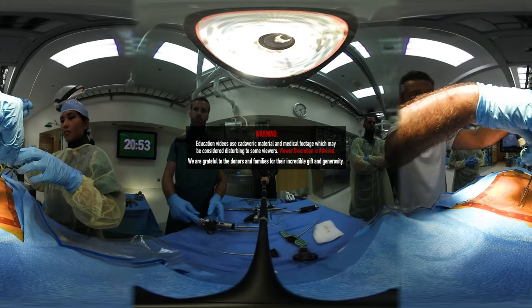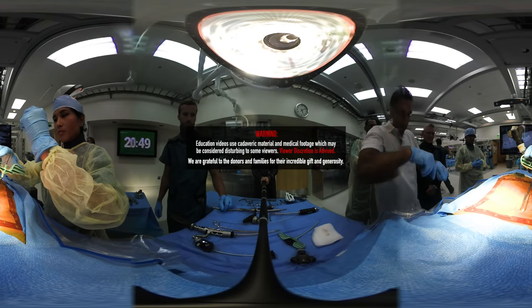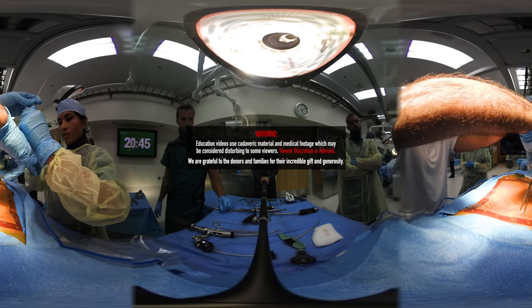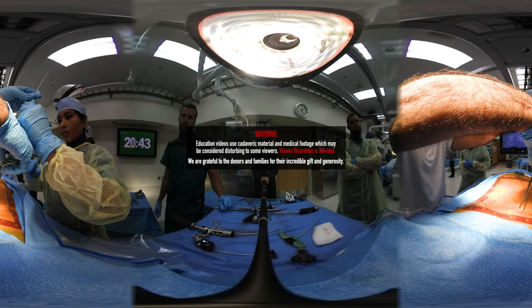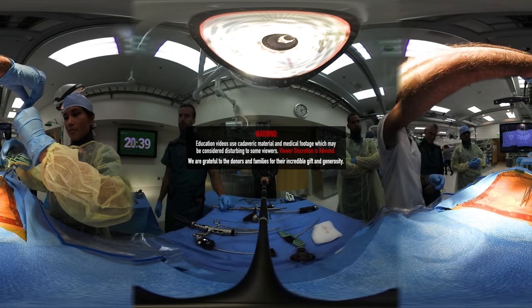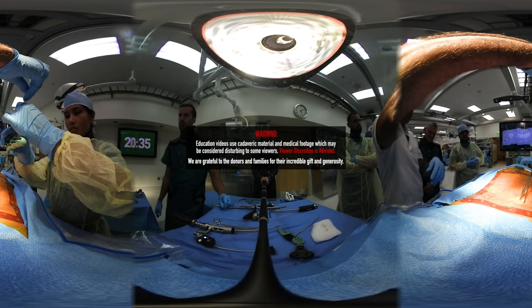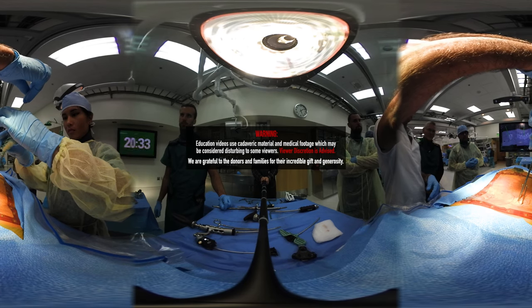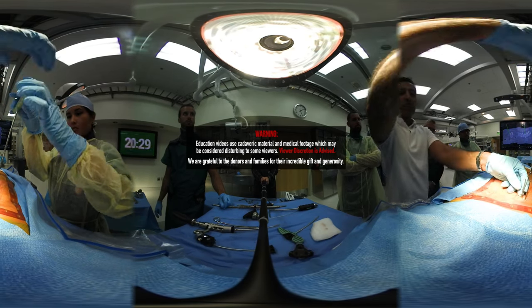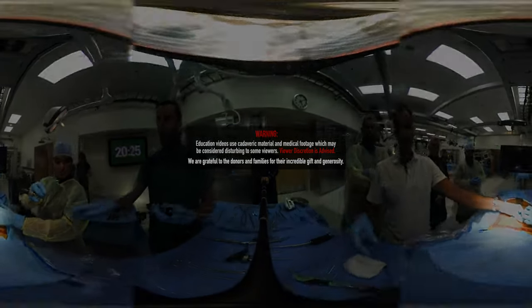So now you're going to continue to push this down as you twist the green to pull it out. One you're pushing down, the other you're pulling up. It's really not a pull, but it's more like just a gentle twist and you let it work itself right out. Really twist, just let it come at the same angle. Keep going. Now just slide it right out. Next thing you're going to do, you're going to take your next instrument, which is called a tap.